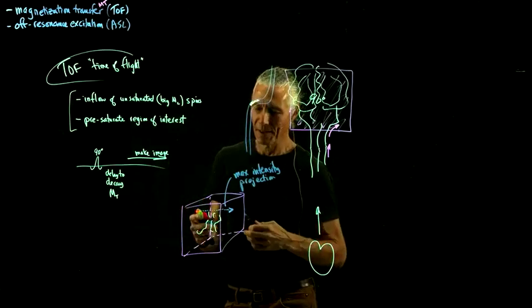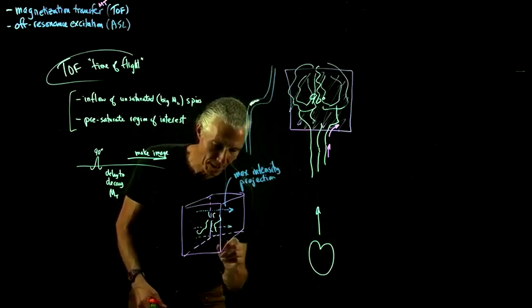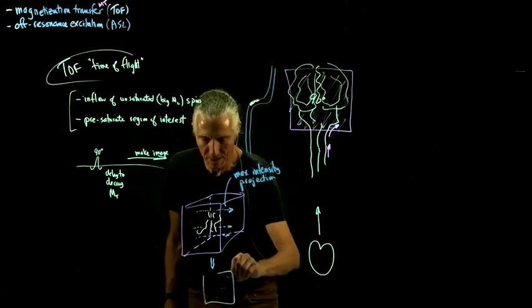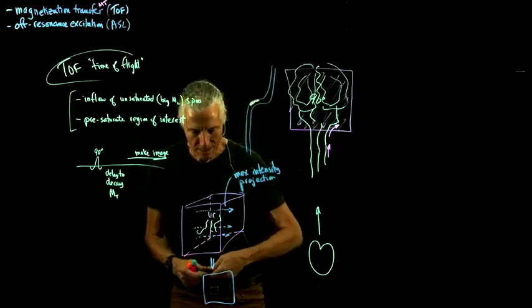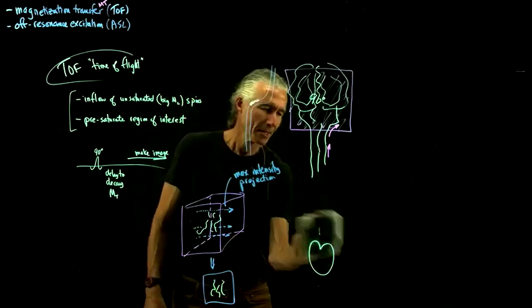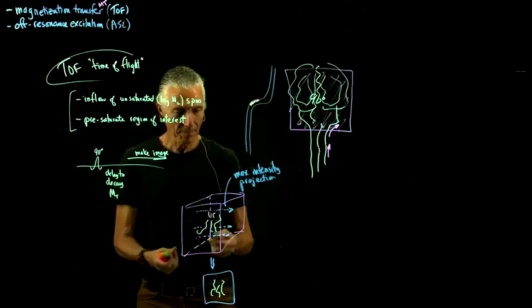That's it. So if you do that, and then do the same thing for all these lines, you end up with a 2D image. So that gives you a single 2D image, and you'll see some blood vessels in it. And so there's your picture of blood vessels. And then just do it again. So this is a very easy computation because you just go through the block, finding the maximum.